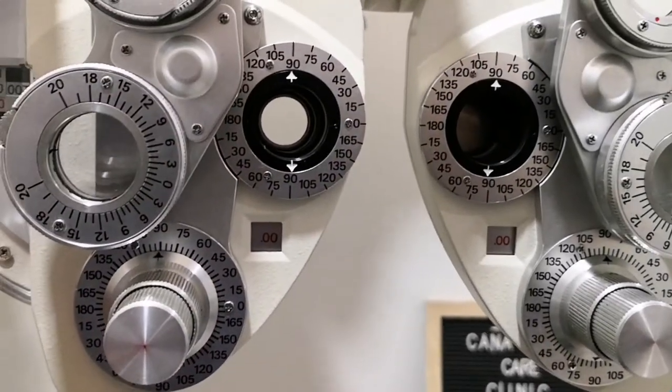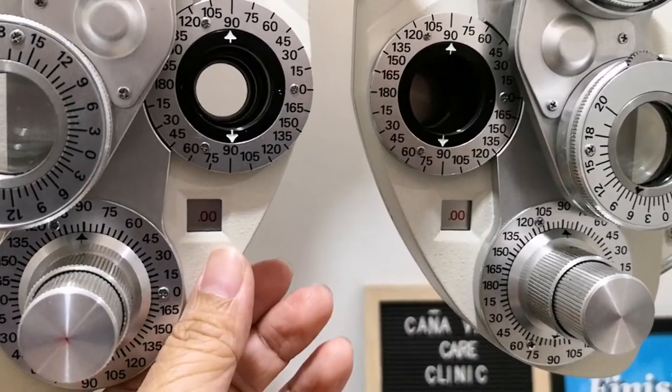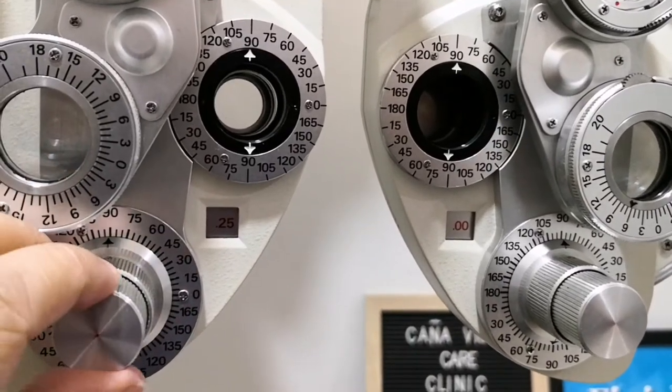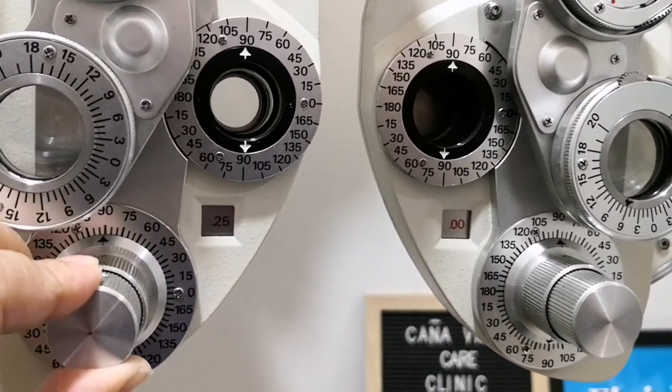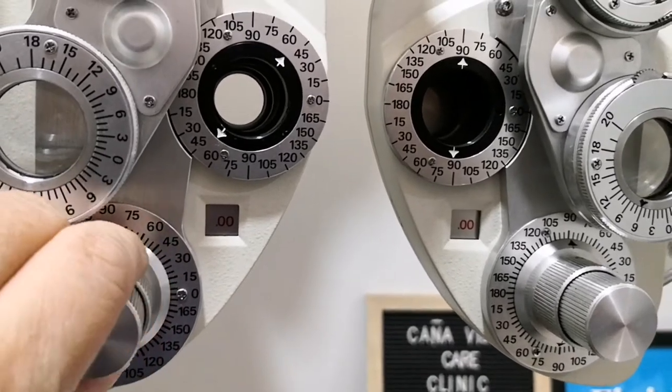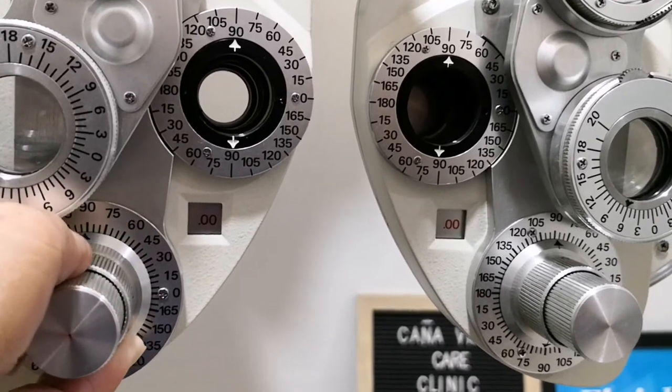And this is the minus plano cylinder control. This is the scale. This is the cylinder power knob, also by 0.25. And this is the cylinder axis knob where we rotate the cylindrical axis.